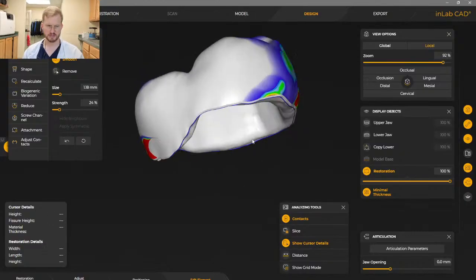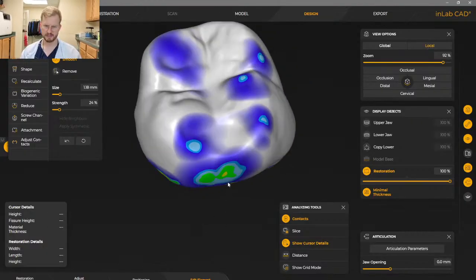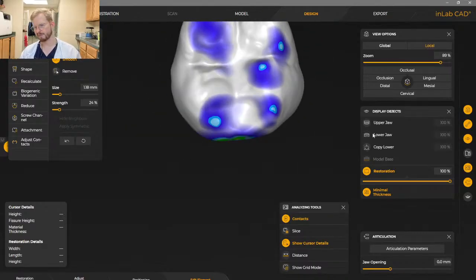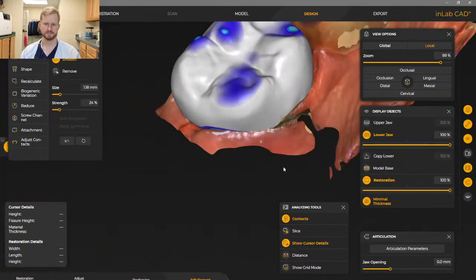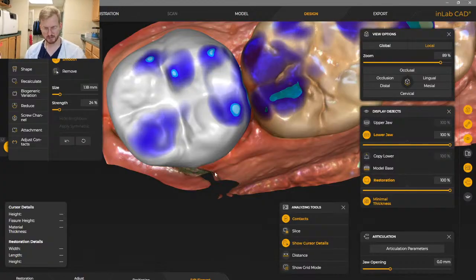See the red down there is just the gum tissue. This is all gum tissue. That doesn't bother me. I will just leave that contact that's nice and flat. It's going to give me a good pop on the floss. Normally I wouldn't do that, but because it's the most distal tooth, it's going to be fine. Probably better, actually, with a little bit of yellow in it. At least that's how they teach you in level 2 CDOCs.